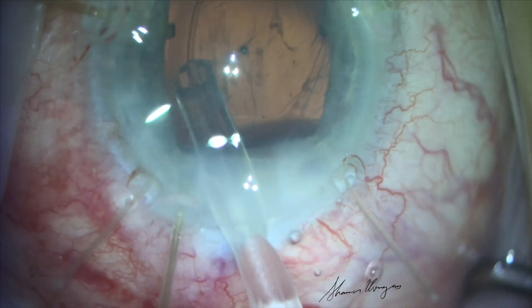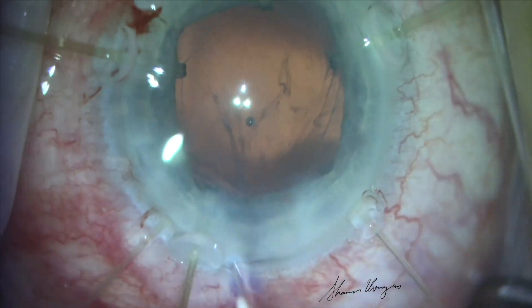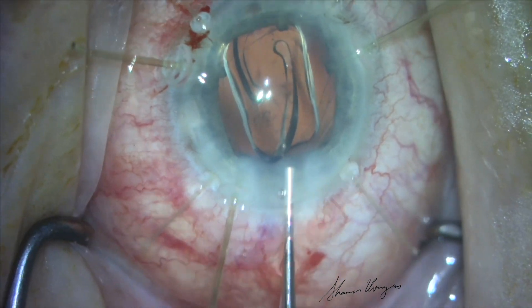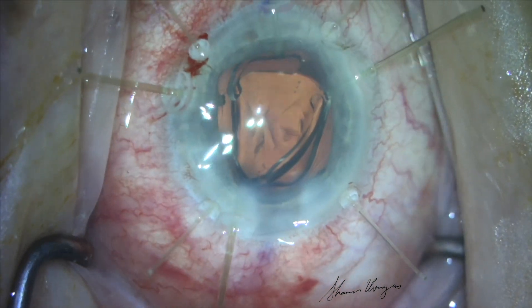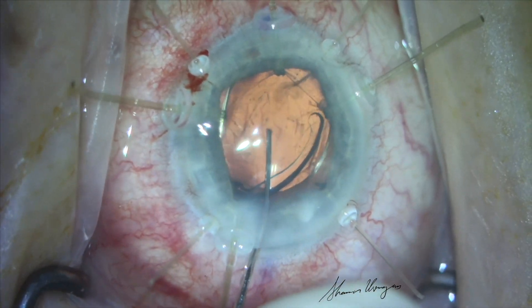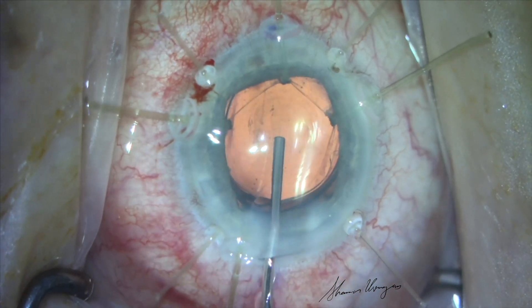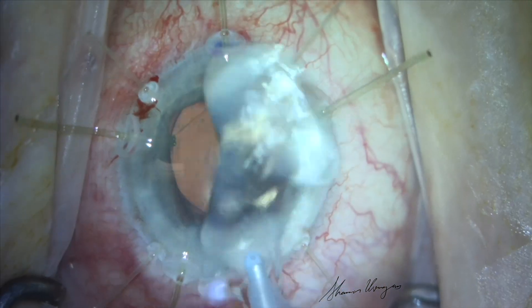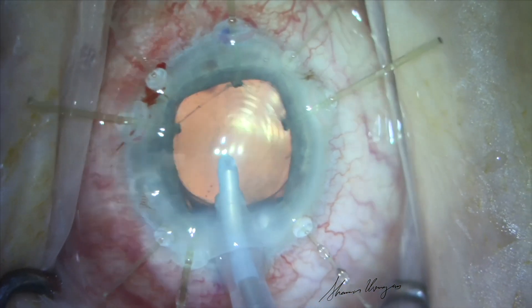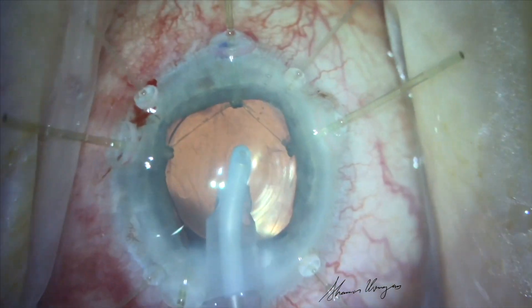A capsular tension ring is inserted to stabilize the capsular bag. The panoptics lens is then placed into the bag. Throughout the procedure, the patient moves quite a bit. When we insert the IA, you can get a sense of the patient's movement. This panoptics toric lens will need to be rotated into position in the presence of capsule retractors and a capsular tension ring.